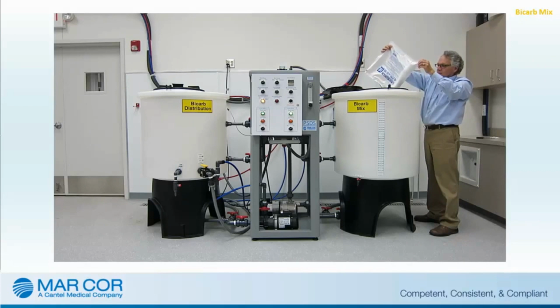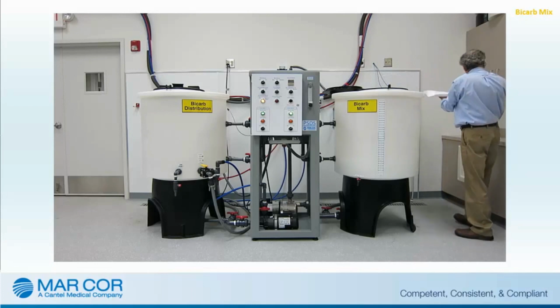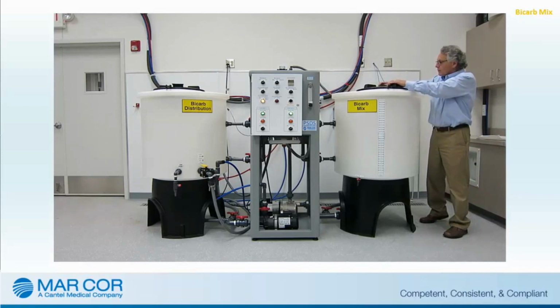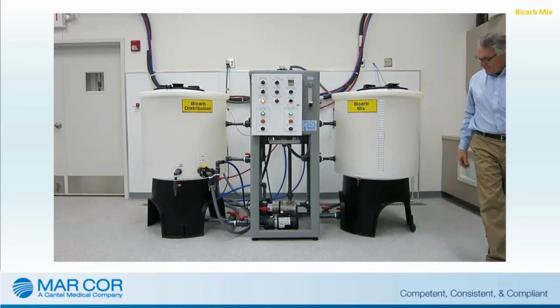The mix pump will operate for a maximum of 10 minutes. If additional mixing is required, cycle the hand switch from mix to off and back to mix to restart the pump. Do not overmix the bicarb concentrate. Overmixing can cause CO2 loss and can increase the pH of the bicarb concentrate.